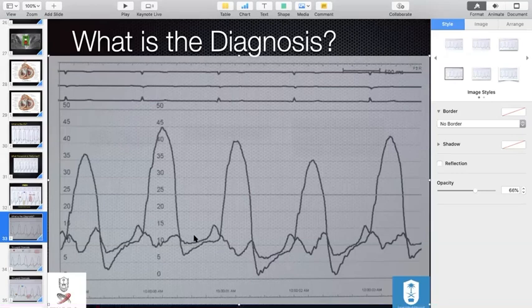Here, look at diastole. What happens? It's actually upslope, right? Upslope. So this is ventricular versus atrial. Look at the peak. How many peaks for every QRS? Only one. So that goes with ventricular. The peak is within the STT segment. So that goes with ventricular. So I have an RA and RV.